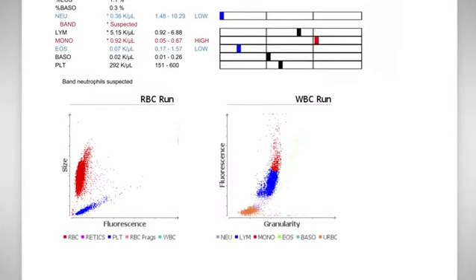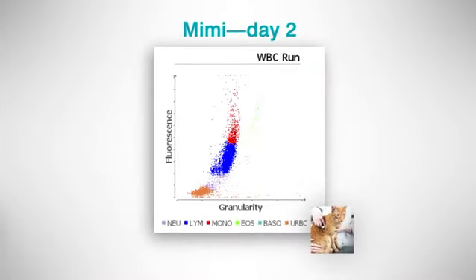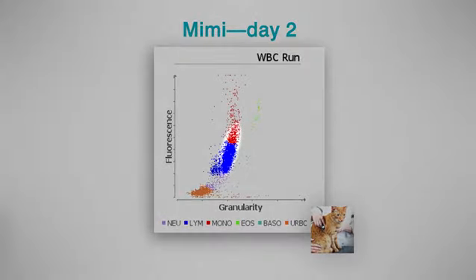When the asterisk qualifier is provided, the user is instructed to verify numerical results with dot plot and/or blood film review. In most situations, dot plot review provides a valuable insight into the abnormalities present. In this case, the abnormal dot plot pattern reveals a continuum of dots with blue dots on the bottom and red dots on the top.